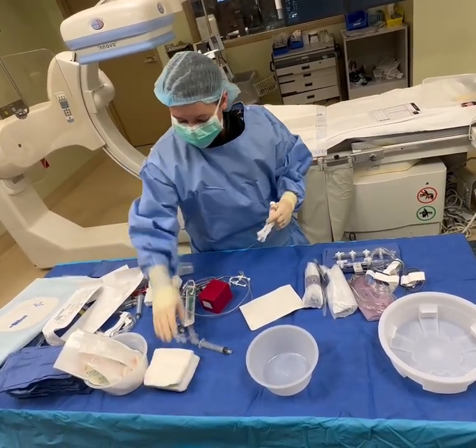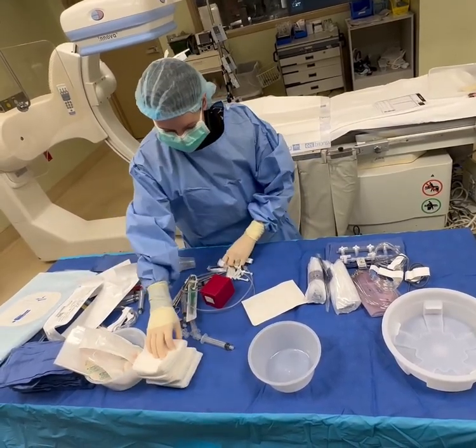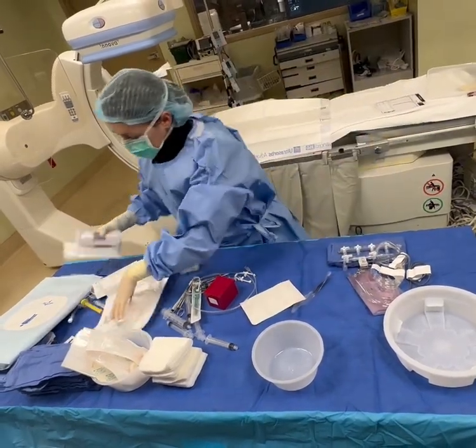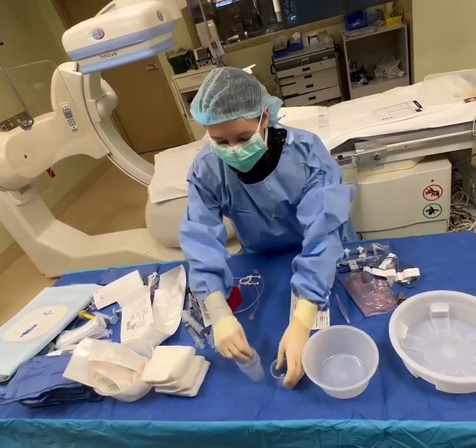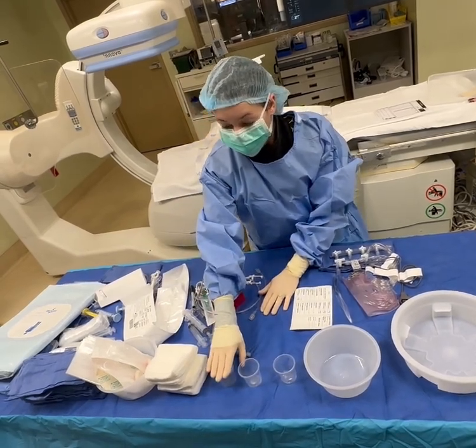I'm going to unwrap all my gauze because eventually I will probably hoard them and use them. Everything's going in my trash. These are the ones over here. All right, manifold's right here. Labels are ready to rock and roll. I'm going to set my medicine cups up. Ooh, I got lucky and got three. One's most likely going to be for lidocaine. It has to be.